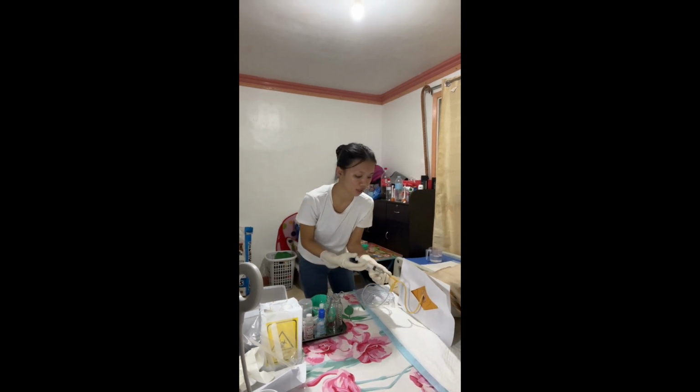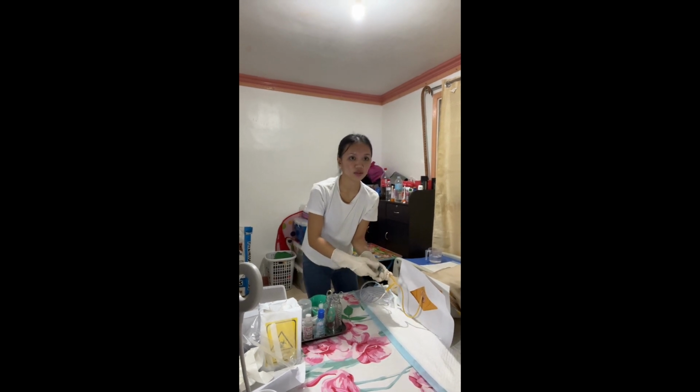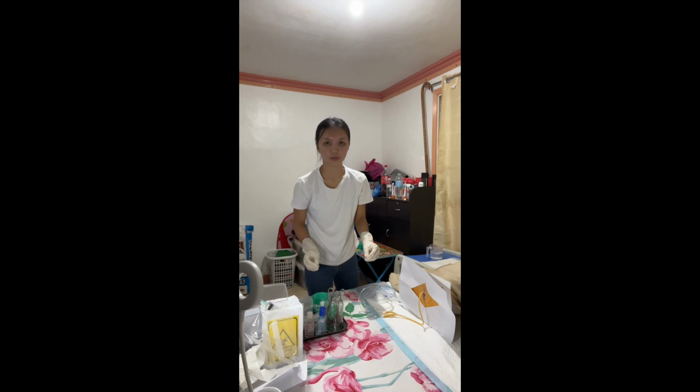Now I'm going to inflate the catheter. Okay, so next, we are going to discard this one.